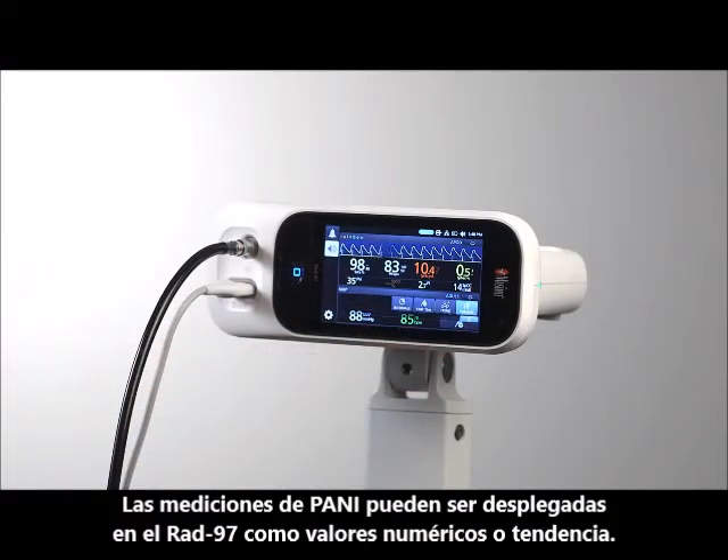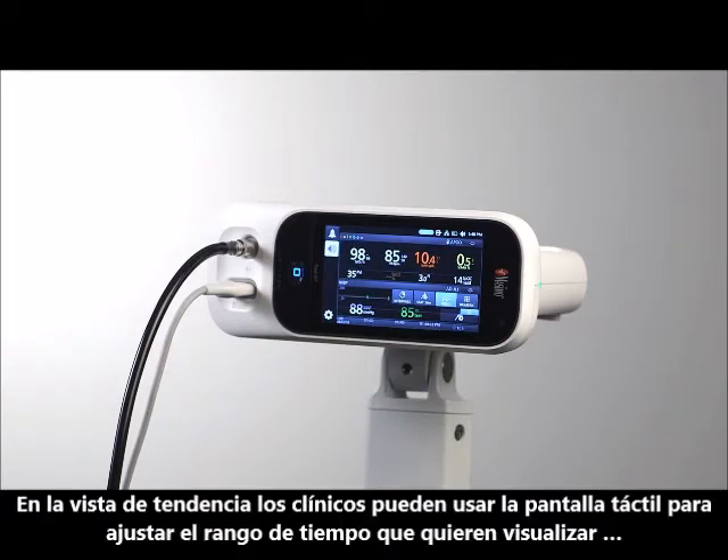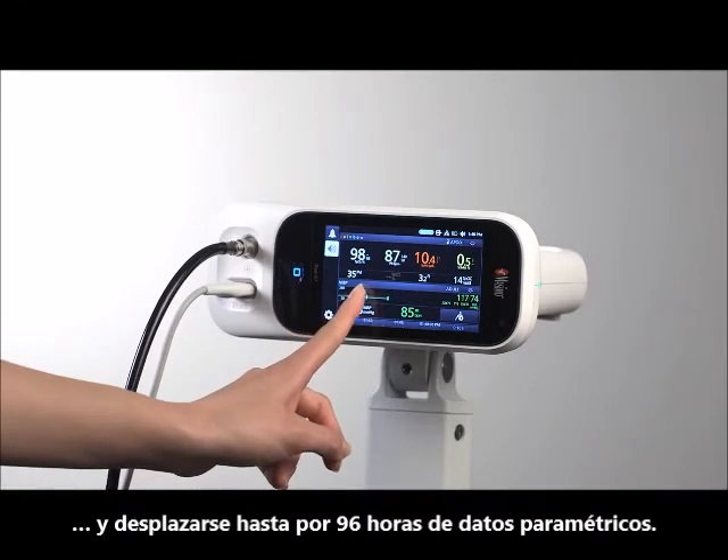NIBP measurements can be displayed on RAD97 in Numeric or Trend View. In Trend View, clinicians can use the multi-touch screen to adjust the range of trend time displayed and scroll through up to 96 hours of parametric data.